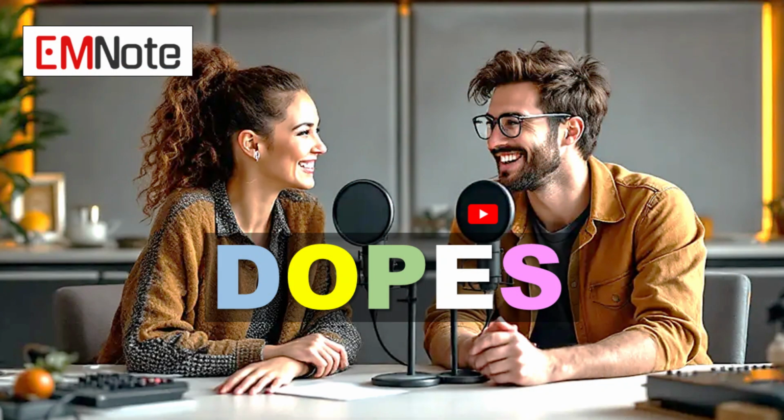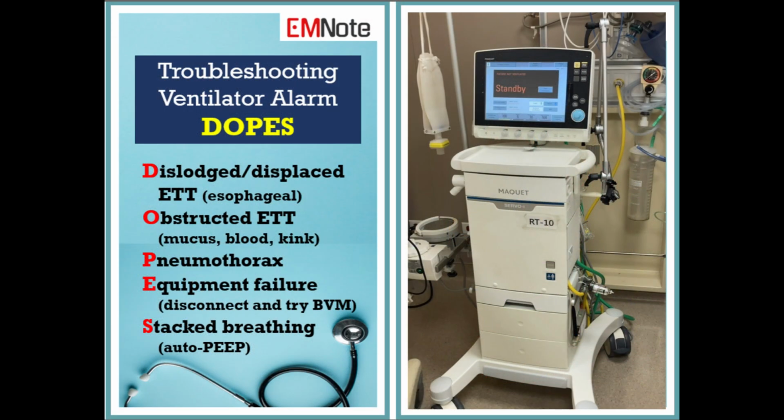Definitely. And with us today, we have an absolute pro when it comes to all things ventilator management. Happy to be here. So let's jump right in. DOPES: displacement, obstruction, pneumothorax, equipment failure, and stacked breaths. Easy to remember, right? Yes, definitely.